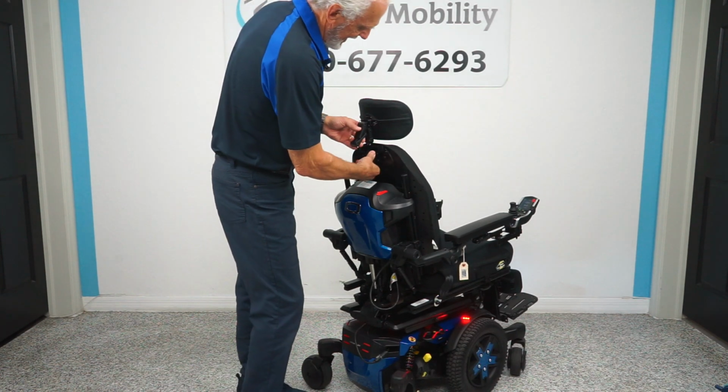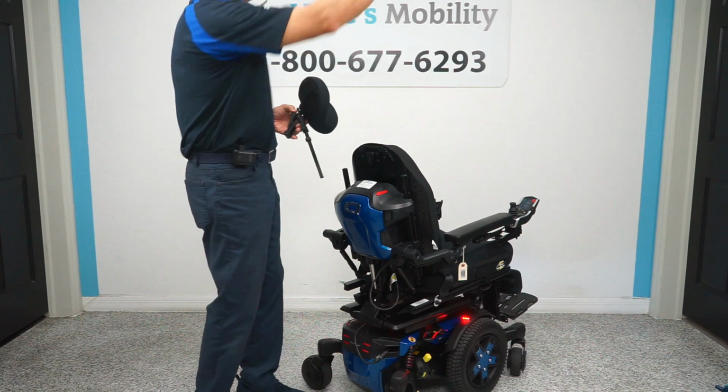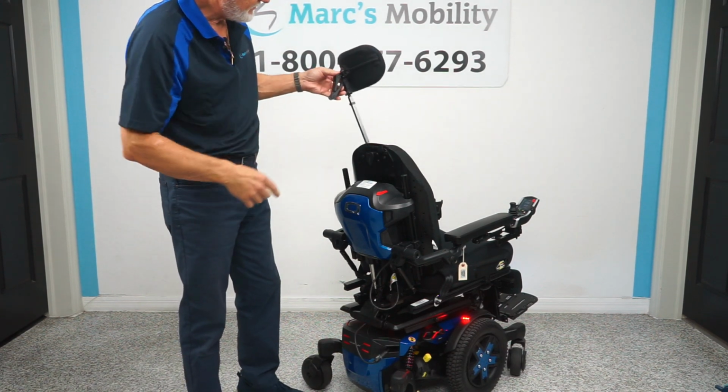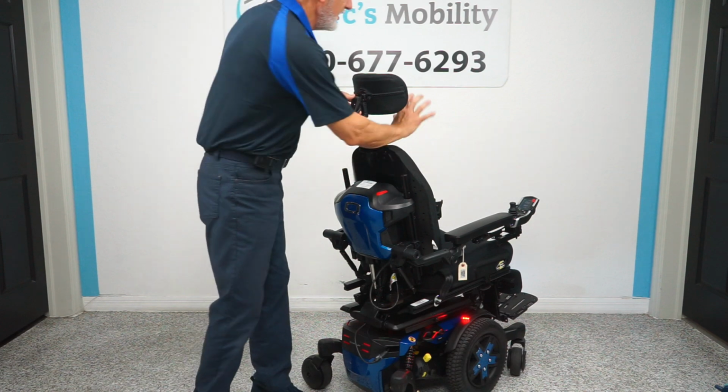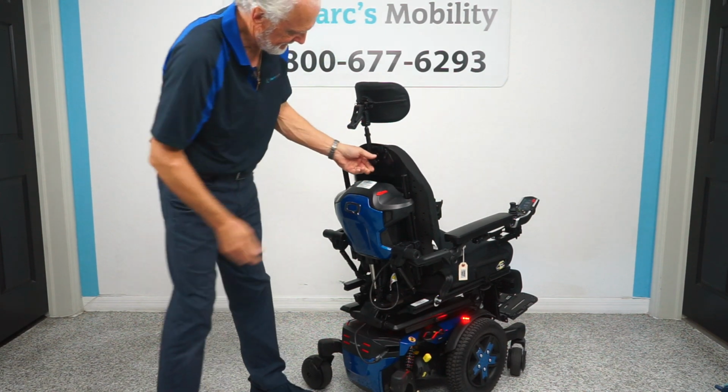Right now it's all retracted, but you can see all this right here. You can extend that headrest way out there. It's kind of stowed away, but there's a bunch of adjustments. So this headrest will definitely, if you want it here to reach your head, there's no problem at all. Okay?